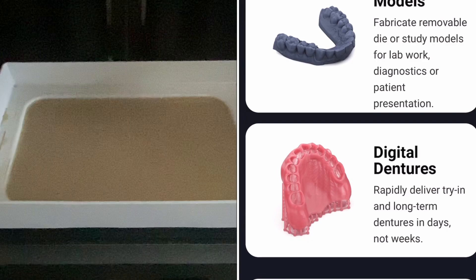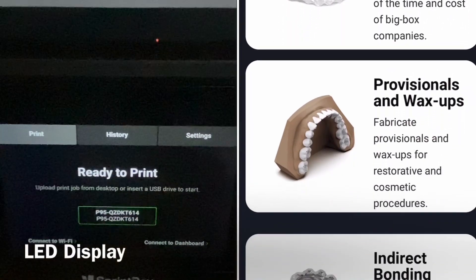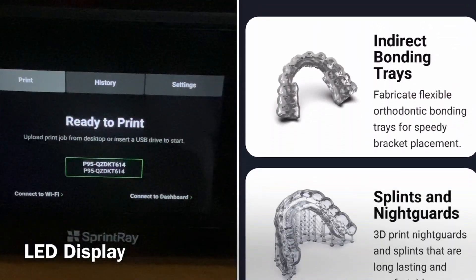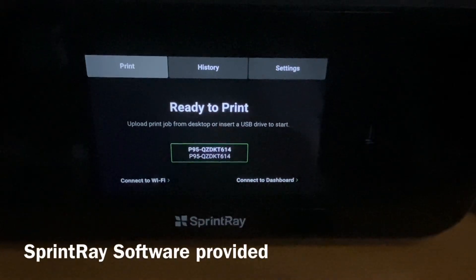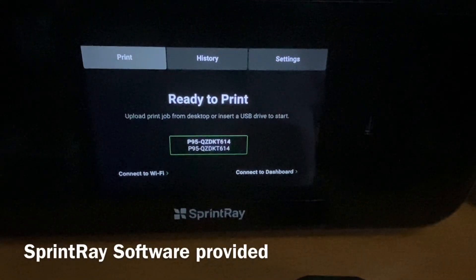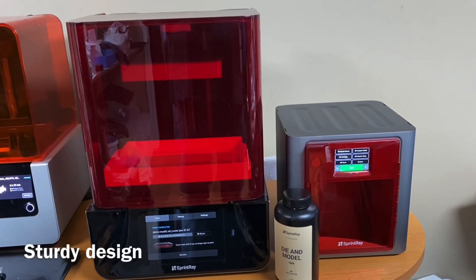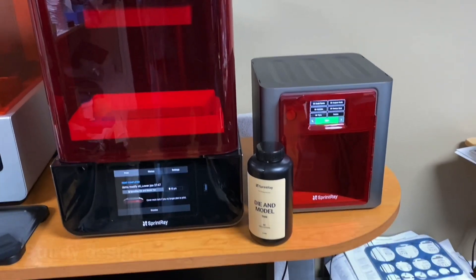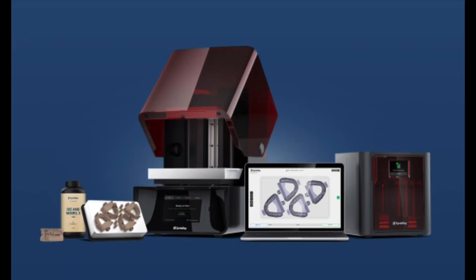You can see the nice LED readout which you can use as a touchscreen. Most of the projects are going to come right from the software provided by Sprintray to your device, so you design it, send it over, and it just starts to print. If you want to change the settings, like the microns for the print - which means changing the resolution - the resolution will determine how accurate the model actually is. More accurate models take a little bit longer to print.